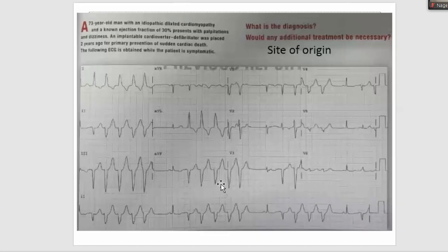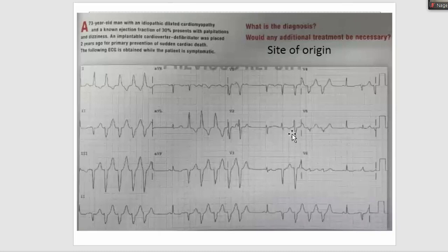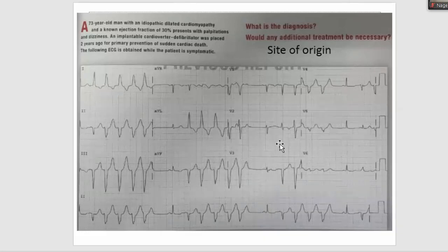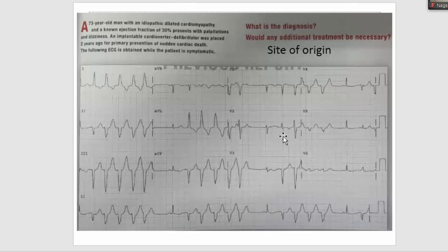Moving to the second part of the ECG — no one should doubt that this is VT, not SVT. In V1 the VPC or non-sustained VT beat is negative, in V2 it suddenly becomes positive, then negative again. This pattern is called a reverse pattern break — a very classical finding. Up to V6 it is negative, which occurs in something called a crux VT.